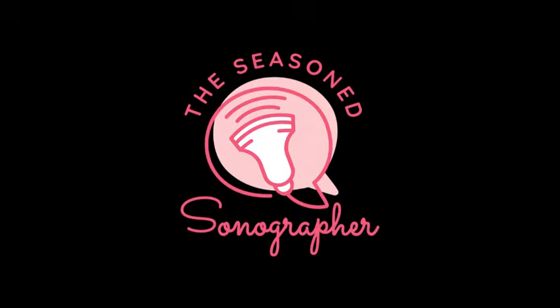Next, the fetal heart. This is a big one. I'll talk in great detail about the fetal heart and obtaining those views in future podcasts, like I said. But for now, let's talk about the 4-chamber heart. You are sliding down from the fetal head transversely through the fetal chest, and you'll see the 4-chamber heart. You're checking for size. Does the heart comprise a third of the fetal chest? You're looking for symmetry, position. Is the apex of the heart pointing towards the left? And you can confirm that by sliding down real quick and peeking at the stomach and sliding back up.